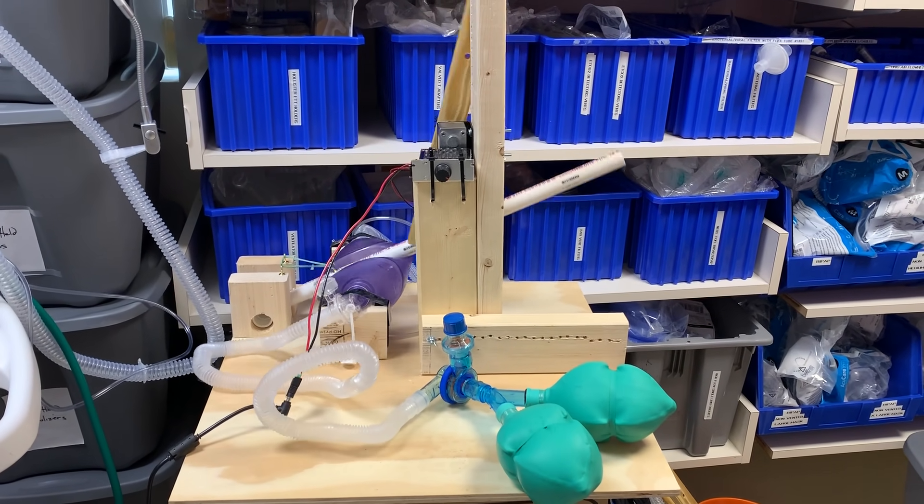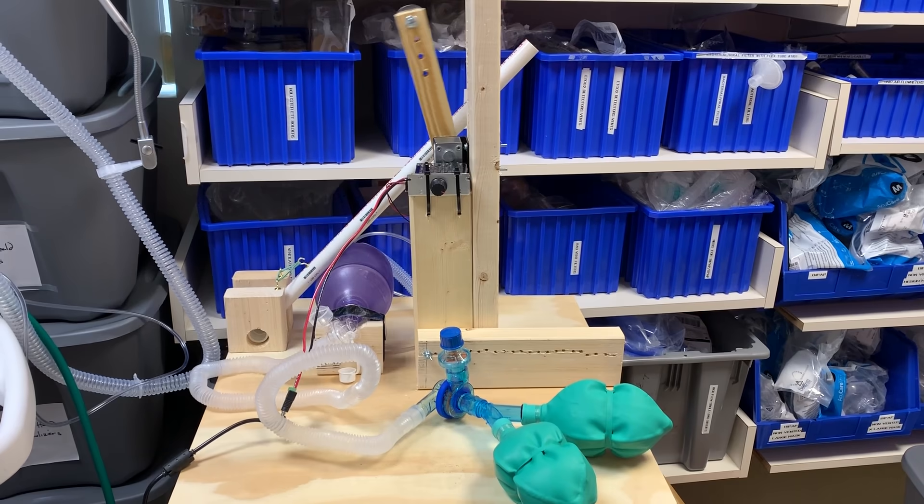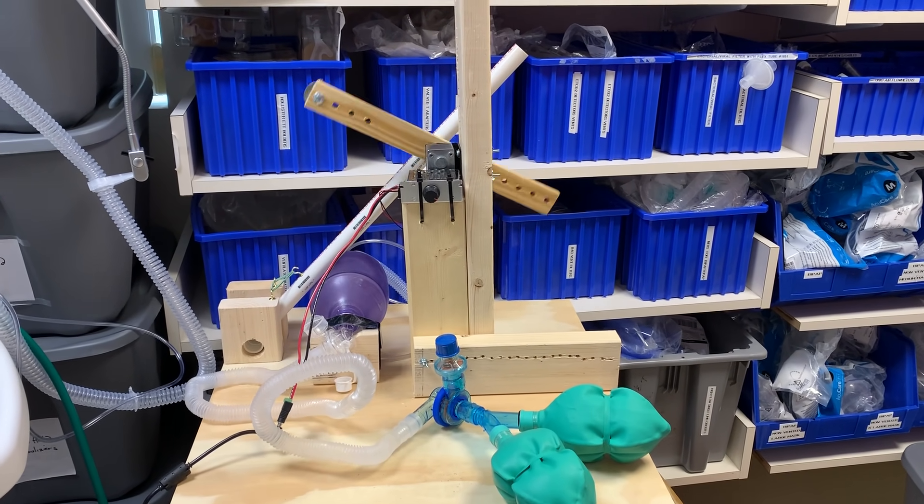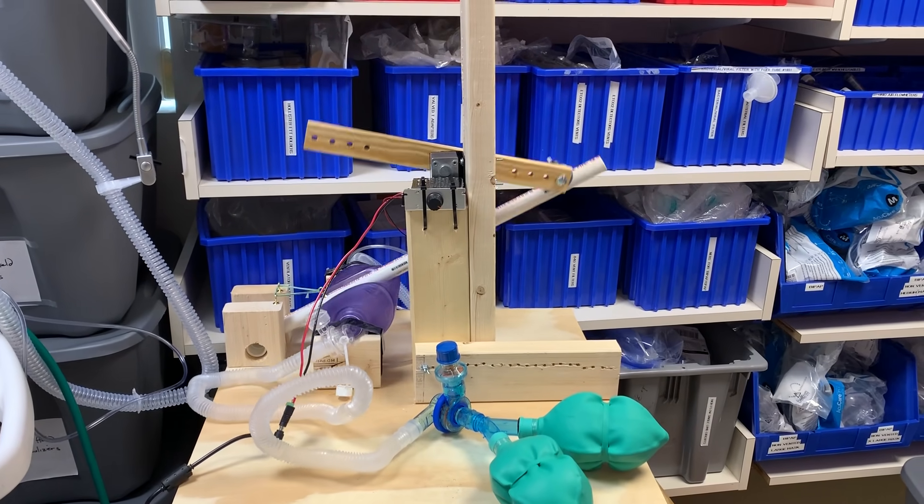Hey, good afternoon all. Hello again. It's Tuesday, March 24th. I'm coming to you now from the sort of workroom slash storage room of the Emerson Hospital Respiratory Lab.